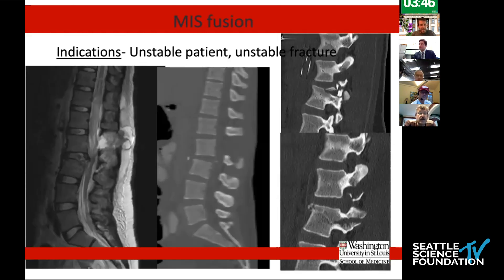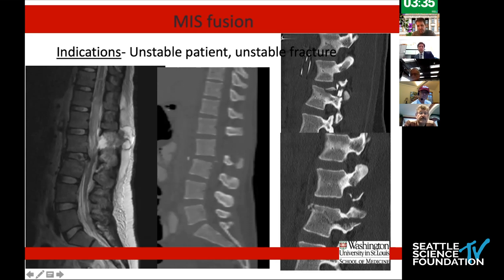This was her imaging. As you can see here, she had a clear disruption of the disc as well as what appeared to be on MRI, clear interspinous ligament disruption. I'm showing the L3 pedicle here and then the L2-3 facet on the contralateral side.